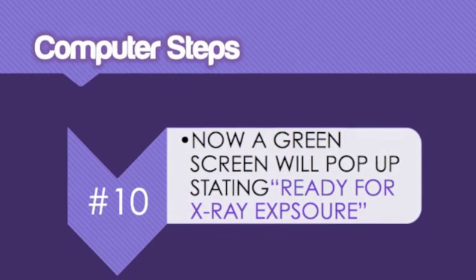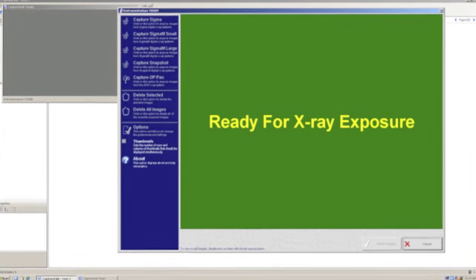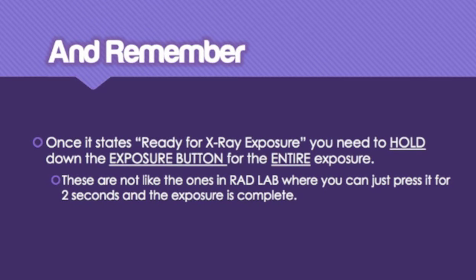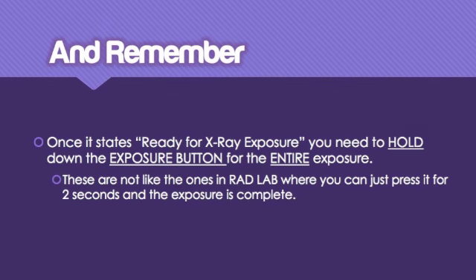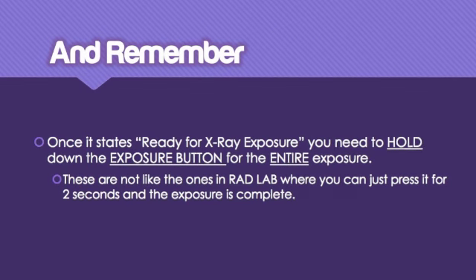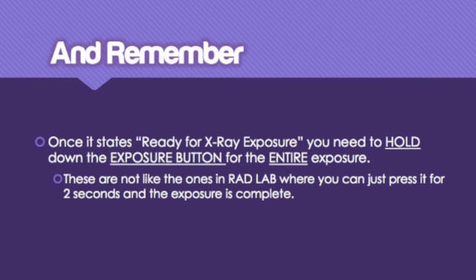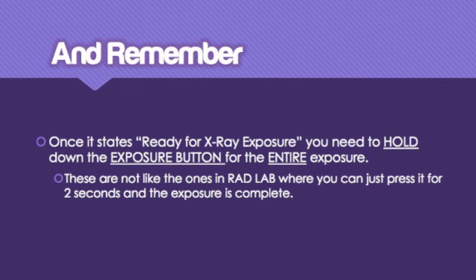Now a green screen will pop up stating that you're ready for your X-ray exposure. And remember, once it states ready for exposure, you need to hold down the exposure button for the entire exposure. These are not like the ones in RadLab where you can just press it for 2 seconds and the exposure is complete.